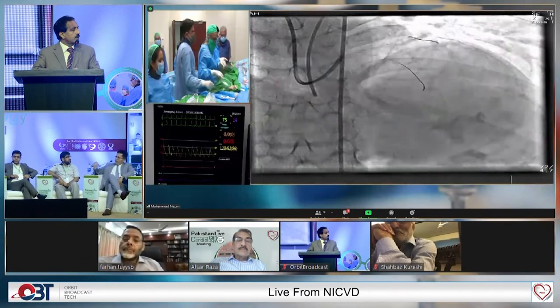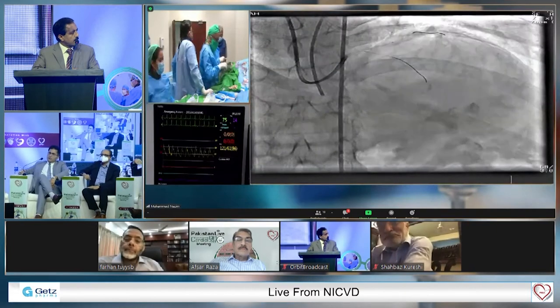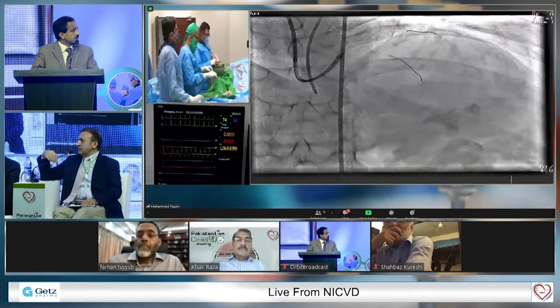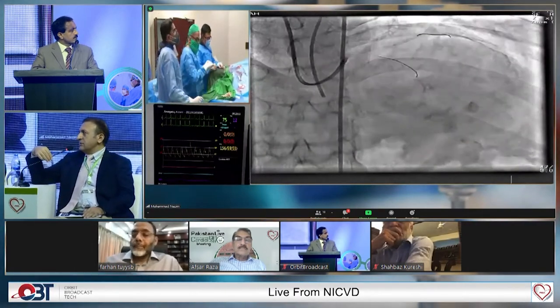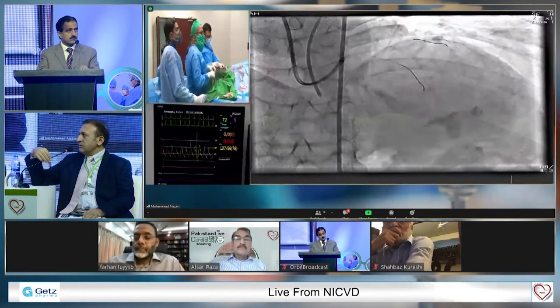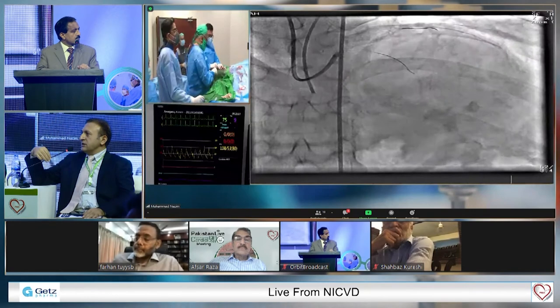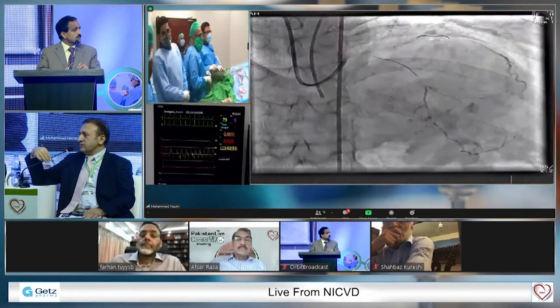Regarding the wire, I think I would have taken a stiffer one, because it was almost subtotal versus total occlusion. And regarding the decision, ideally imaging, but the ostium of the circumflex and the ramus does not have much disease. If we apply the definition criteria of a complex bifurcation, then I would go for single crossover stenting from left main to LAD.